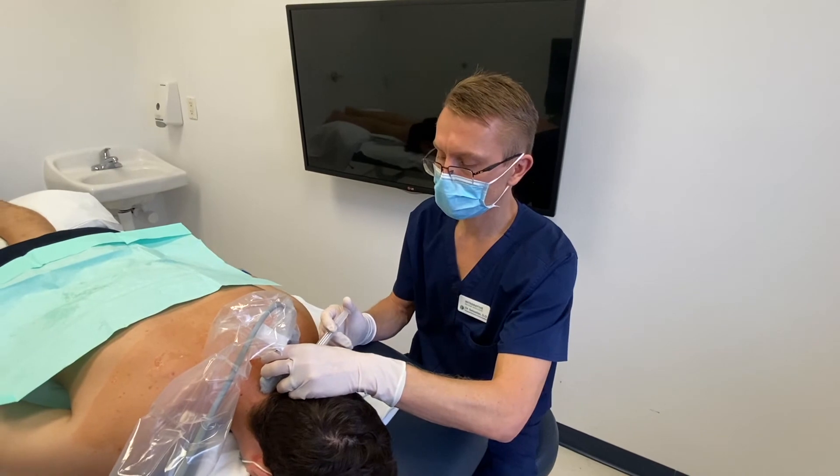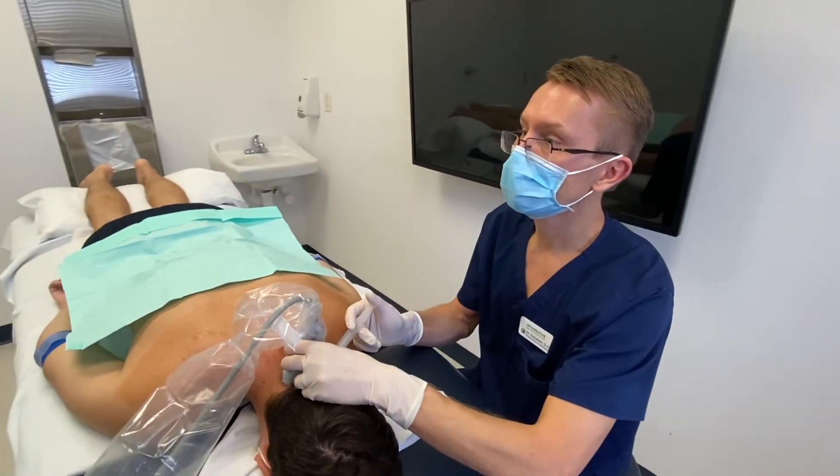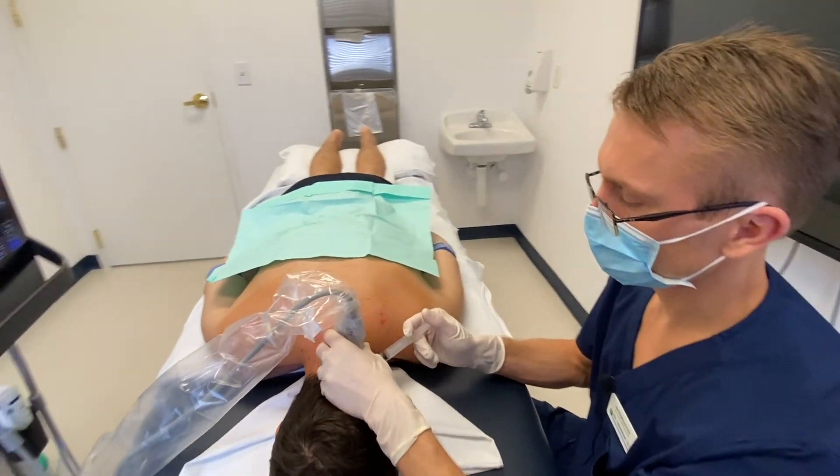I already did the right side and just have a few more areas on the left side, and then he's going to be done.